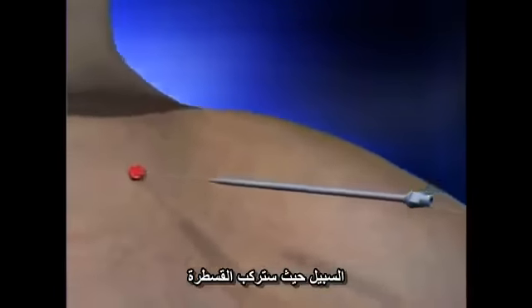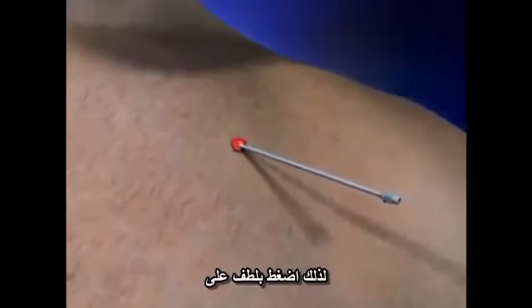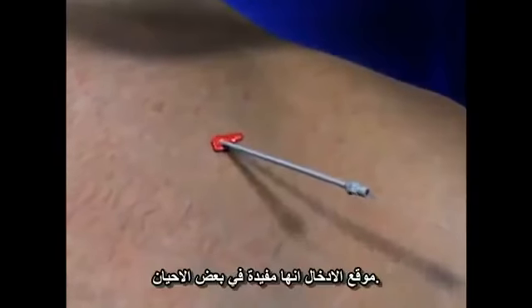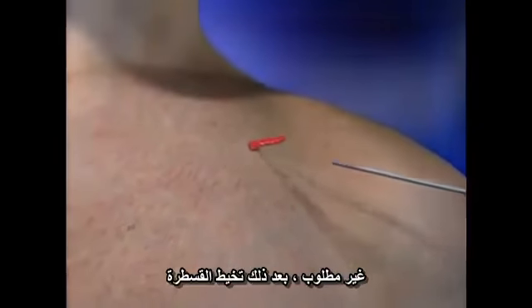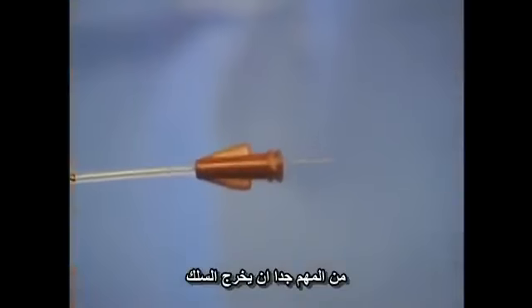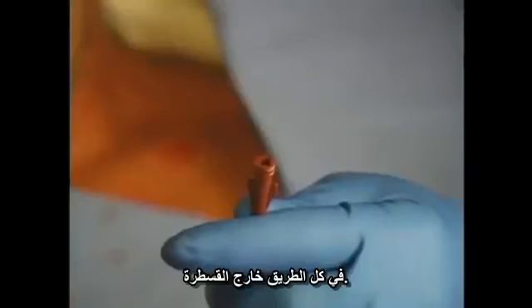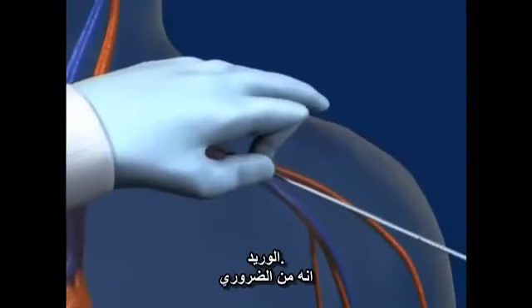The dilator is then used to dilate the track where the catheter will be placed. There will be increased bleeding after dilating, so gentle pressure at the insertion site is often helpful but not required. The catheter is then threaded over the wire into the vein. It is extremely important that the wire be advanced all the way out of the catheter until it exits from the brown hub before beginning to advance the catheter into the vein.